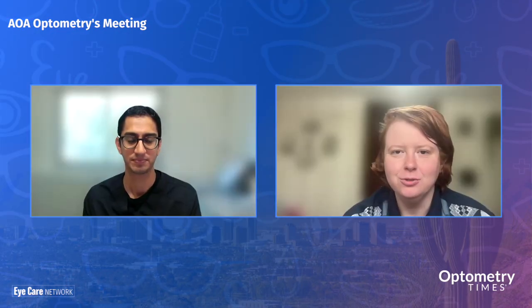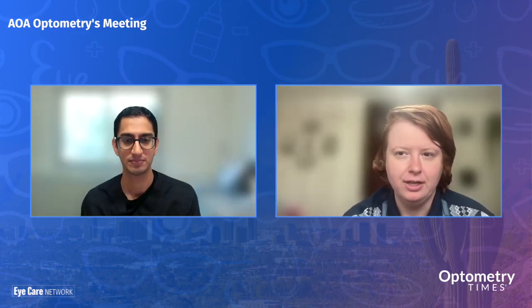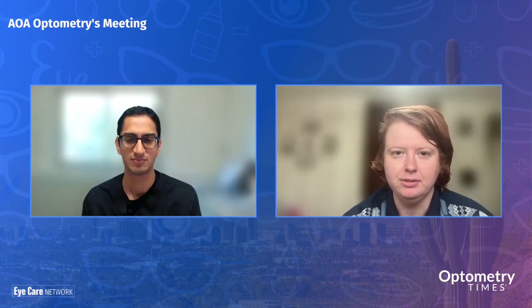So which retinal OCT biomarkers do you believe that every optometrist should be able to confidently identify? I'd probably focus on the two big diseases that we tend to see as optometrists, and that'd be diabetes, like I just mentioned, and the other one would be macular degeneration. So with AMD, we always worry, hey, does the patient have dry or wet? And if they have dry, do they have large amounts of geographic atrophy? And if they have dry, are they possibly going to convert to the wet form?